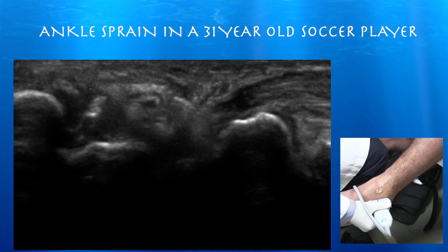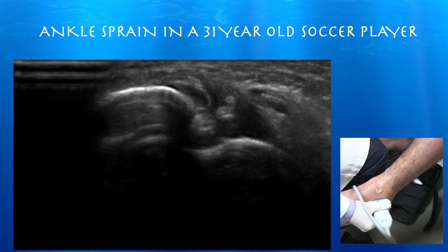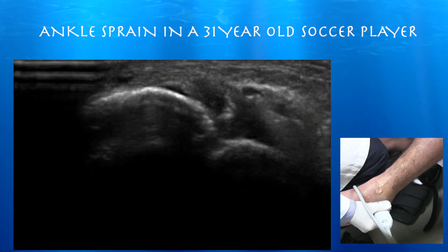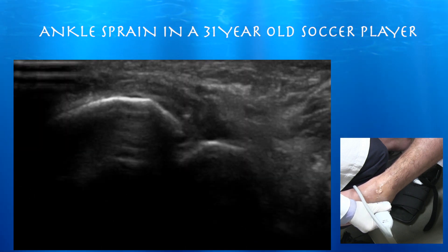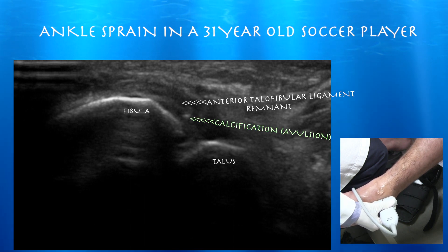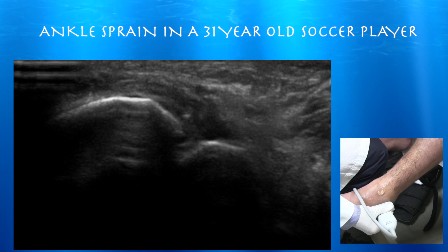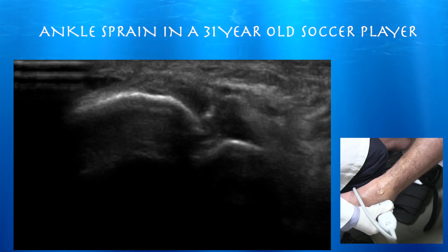Here's the ATFL — a really torn-up anterior talofibular ligament. There may be some remaining fibers here in the ATFL, but it is essentially completely torn. The ultrasound makes the avulsion quite apparent; however, on x-ray it was quite a subtle finding.